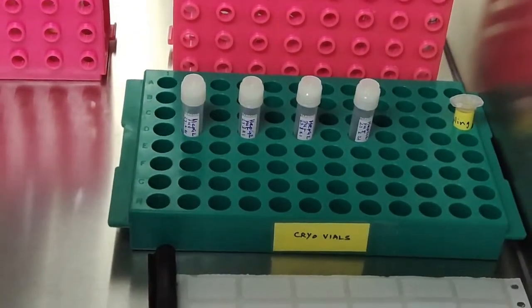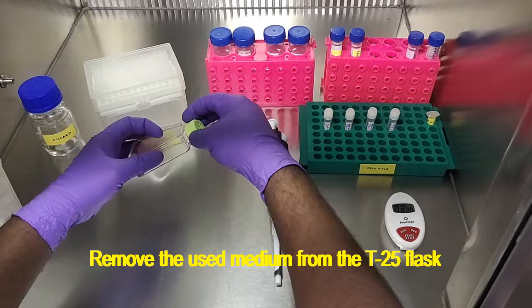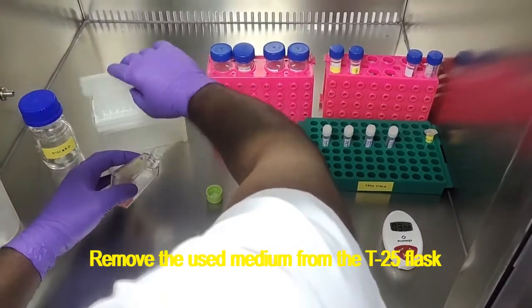Now all the materials are ready, so we can go into the actual procedure. First we need to remove the used medium from the T25 flask.